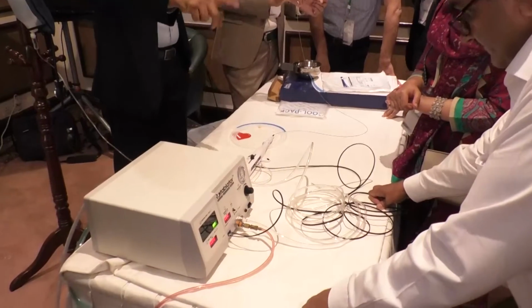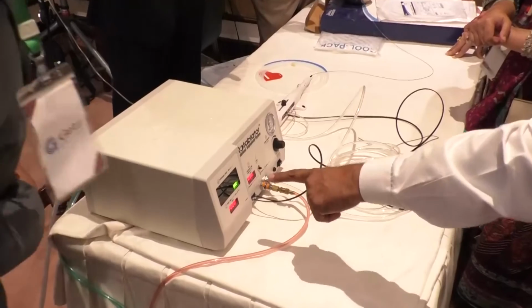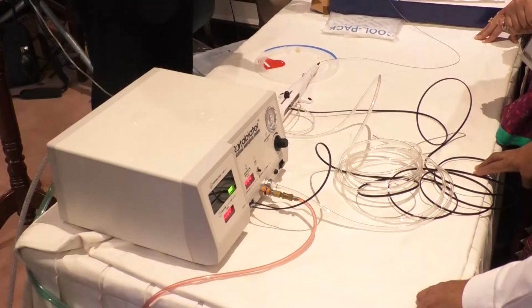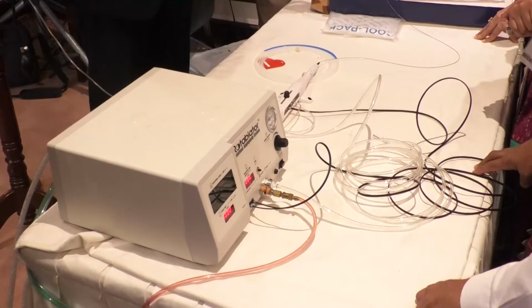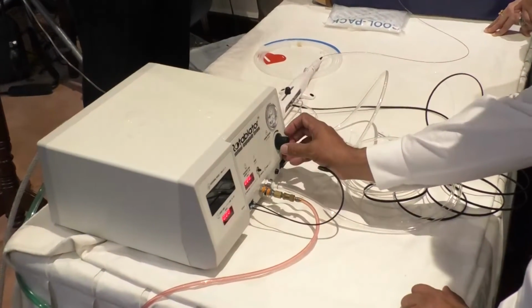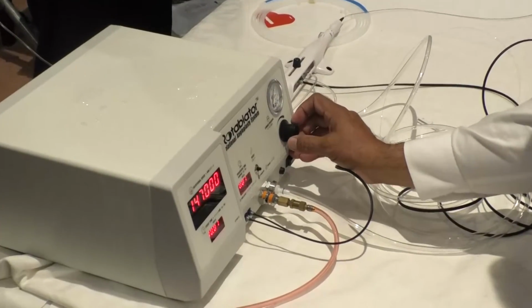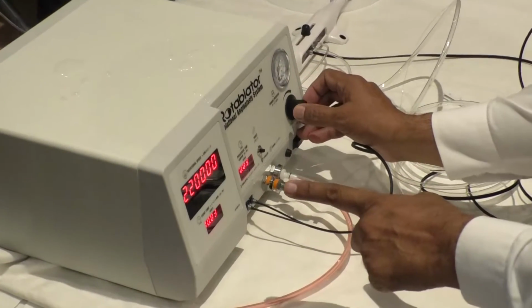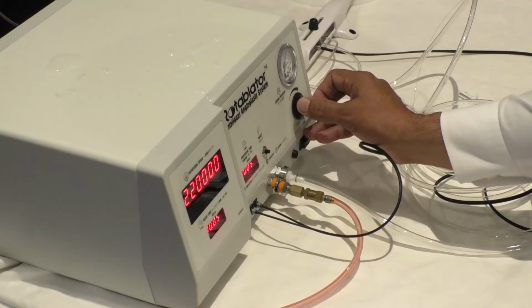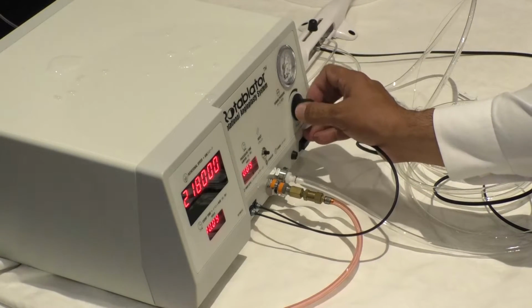Yes. This is the sound. अब दोबारा साउंड सुनें। This is the change of mode sound. ये आपको माननी चाहिए। ये प्रेशर है ना? Yes. ये डायनाग्लाइड, again we will press the dynaglide and set the RPM. Now see the RPM while pressing the dynaglide. Again during this, this will also reduce it to 1/3.